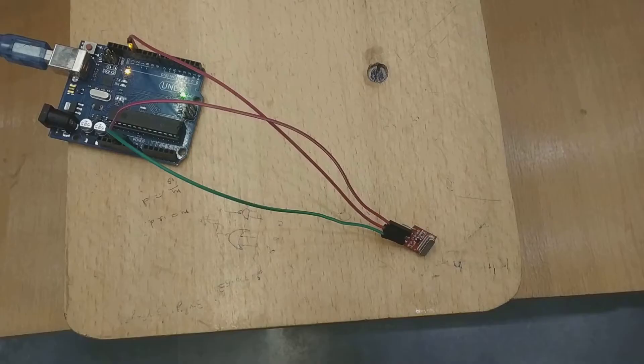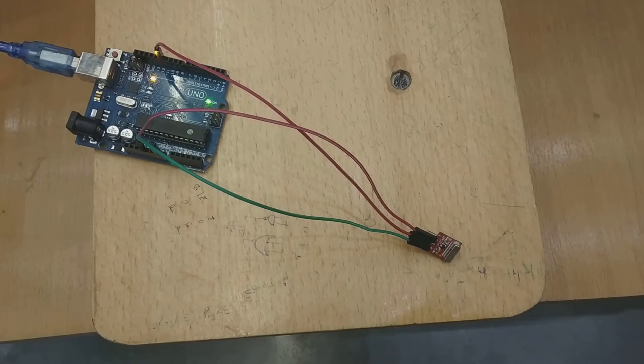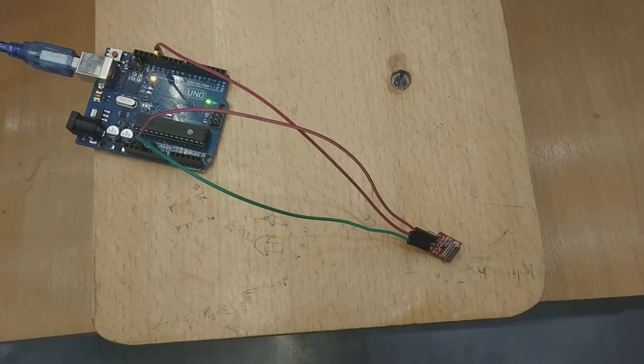The next feature is the LDR sensor, which helps to alert surrounding people in the dark about the blind person. There is also an RF remote control which helps the user locate the stick. By pressing a button on the remote, the buzzer on the stick starts beeping, and through this the user can find his or her stick.